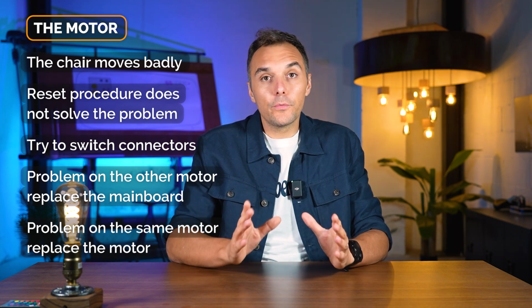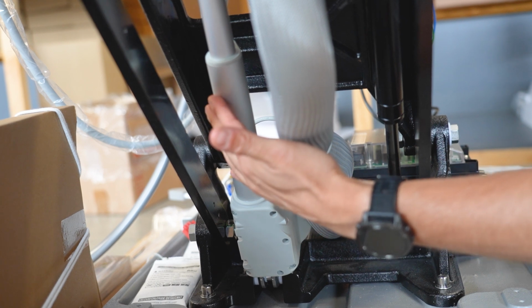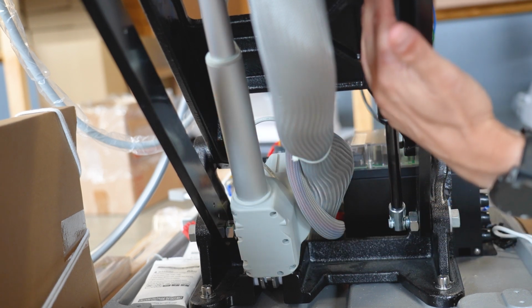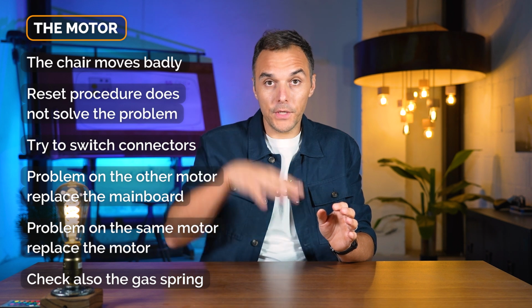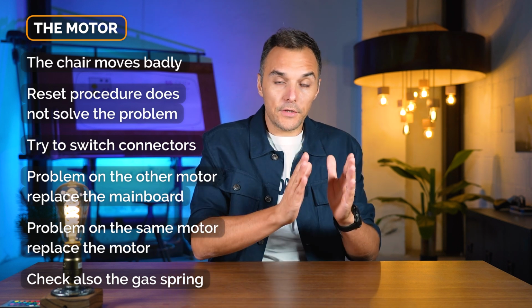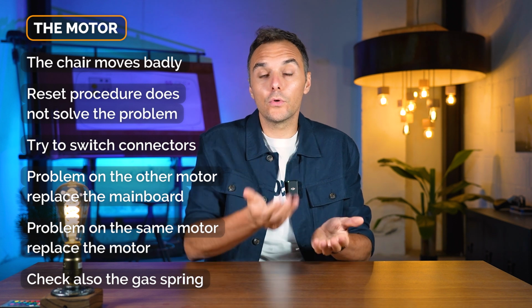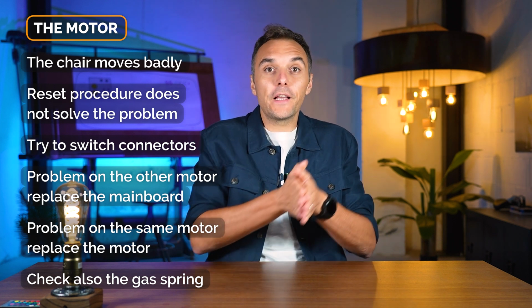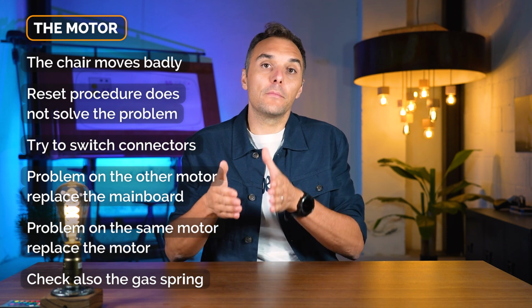But when you do this operation, there is another tip. The motor works when it's helped by a gas spring on the side. I'm talking about the motor that lifts up the chair. You have one motor and the gas spring. The gas spring is the one responsible for helping the motor by lifting it up. If the gas spring is broken, it's the one that is causing the problem to the motor.